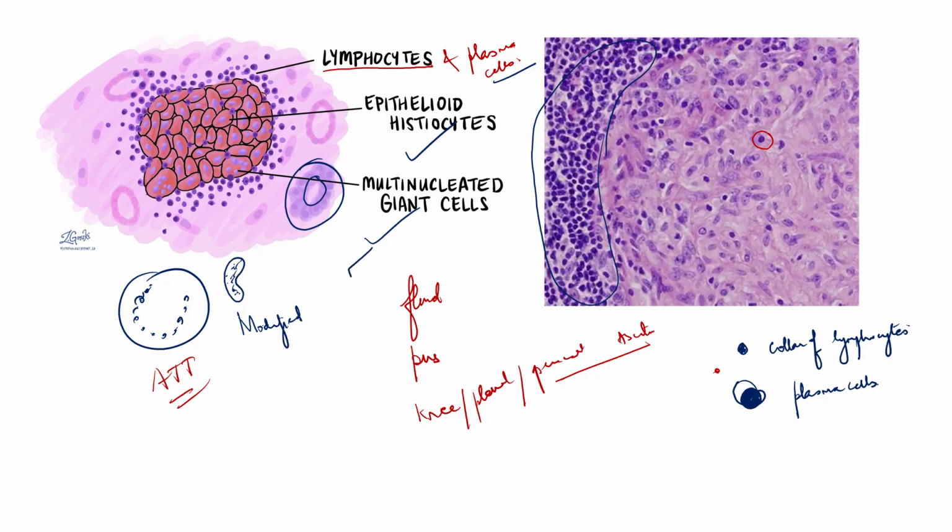That shape was like this. Sometimes people call it a slipper, but I do not see any slipper. I always see a boomerang because maybe I was watching a lot of Mowgli episodes when I was small. So you will see epithelioid histiocytes, multinucleated giant cells, and lymphocytes with plasma cells surrounding it like a collar.